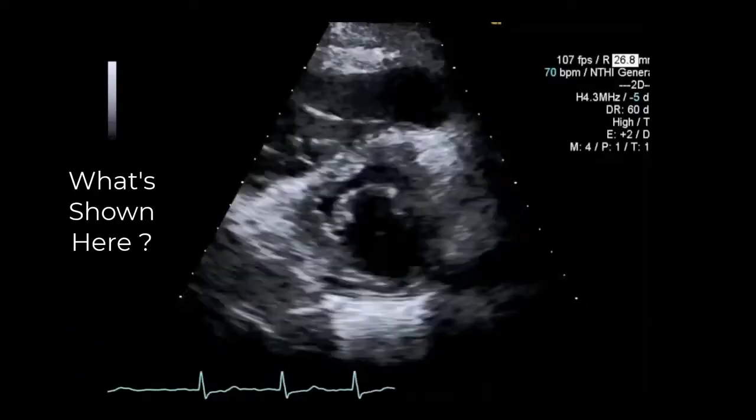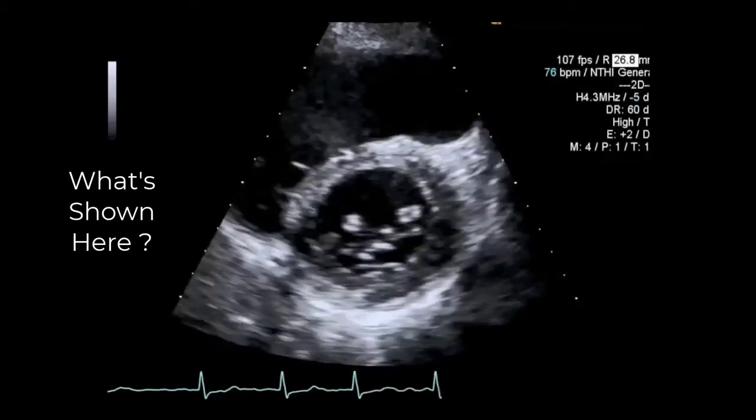One more clip. This patient was hypotensive and complained of shortness of breath. What's shown here?